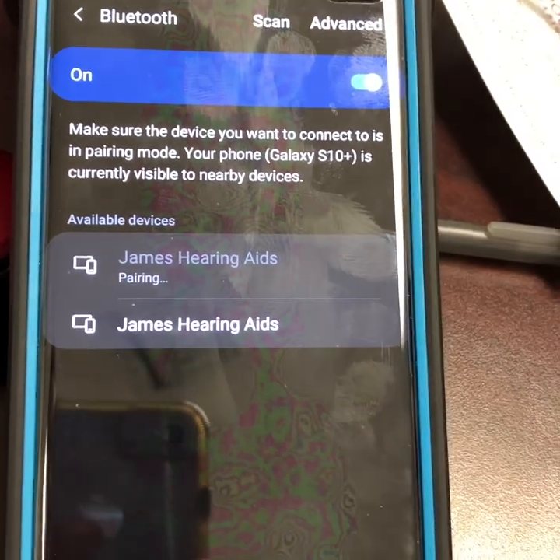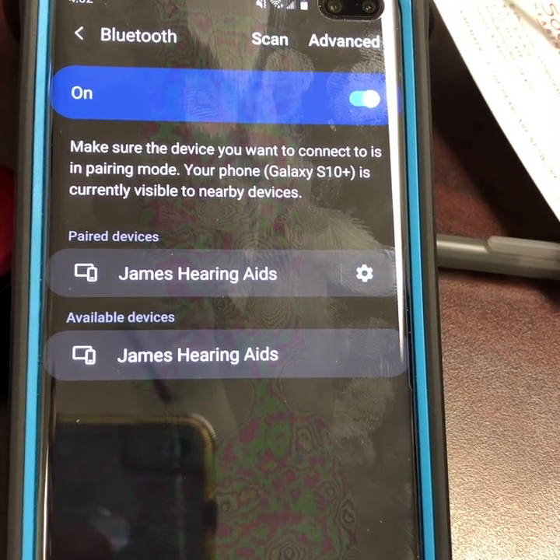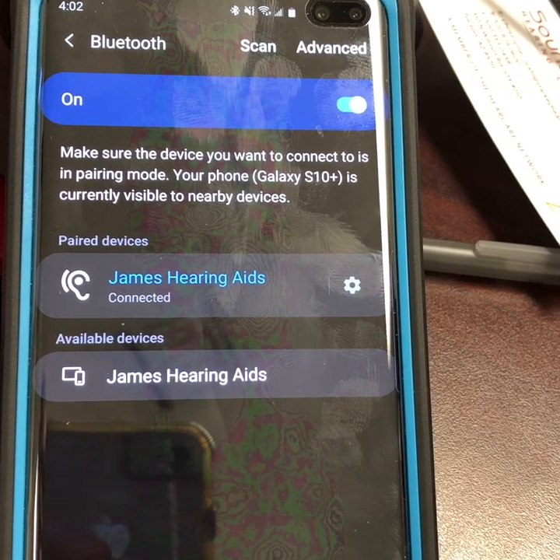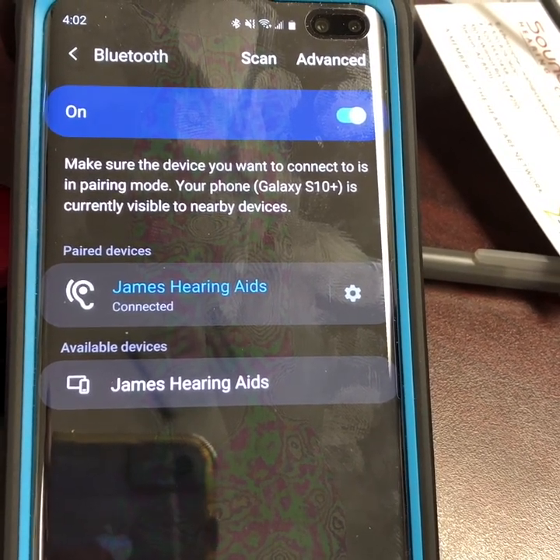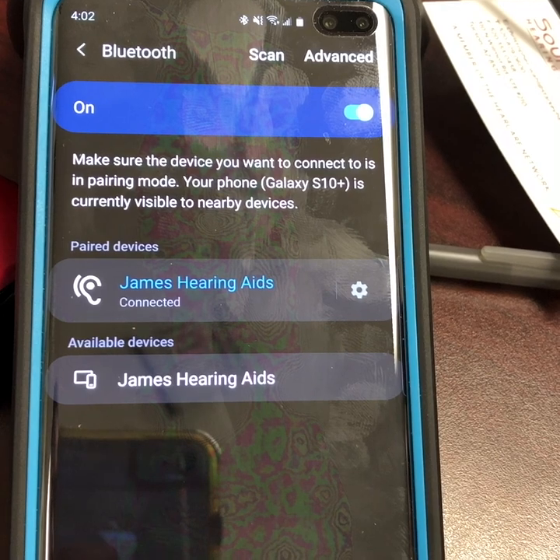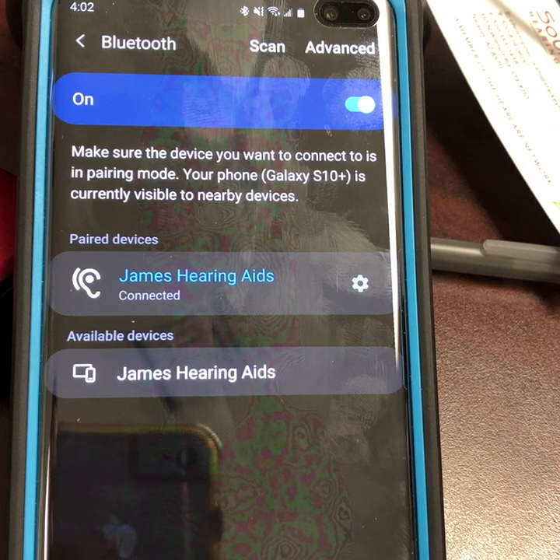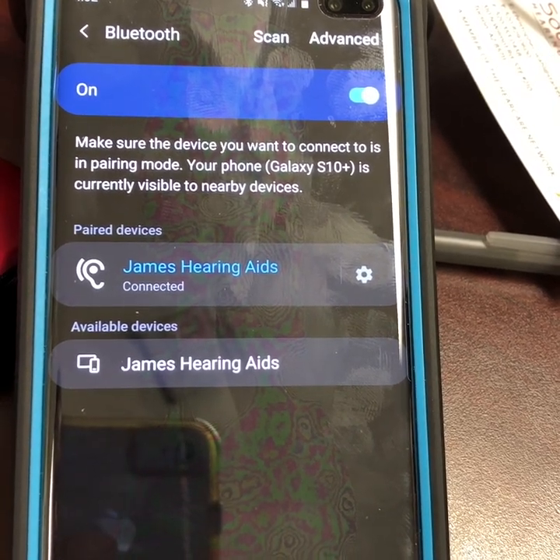30 seconds. Start counting. Make sure 30 seconds has elapsed before you select the second hearing aid. If you select the second hearing aid before 30 seconds, it will fail and will only stream to one hearing aid. This is the step where the Android combines the hearing aids into a single entity of some sort.